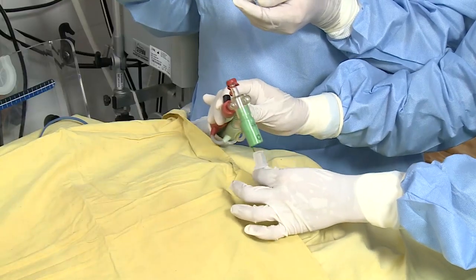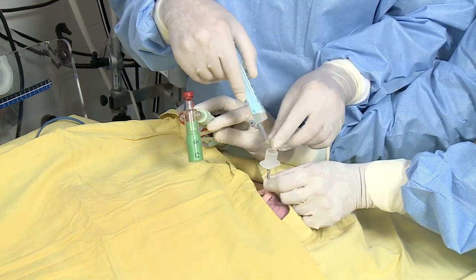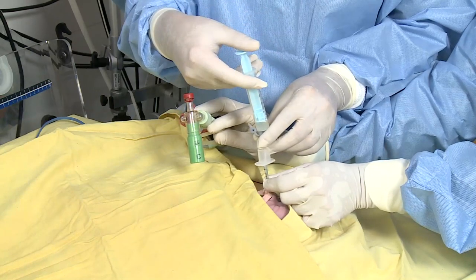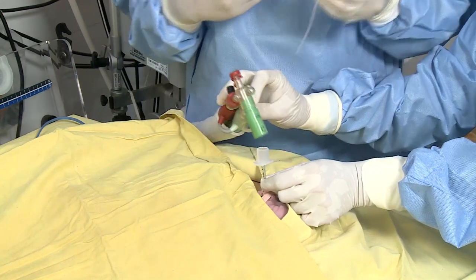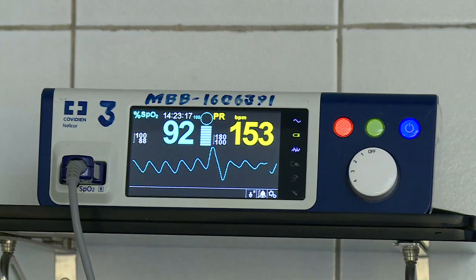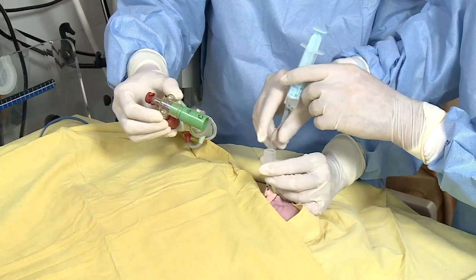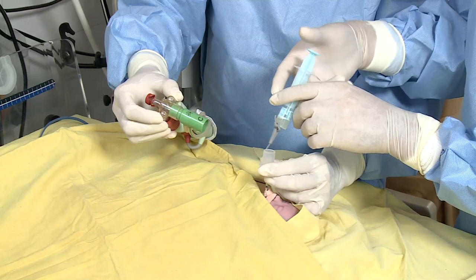Disconnect the ET tube from the ventilator and insert the desired length of orogastric tube. Instill a quarter of the dose with the head in midline position. Reconnect the ventilator and ensure that the heart rate and oxygen saturation stabilize before giving the next aliquot. Give another quarter dose and repeat the process until the drug is fully administered.